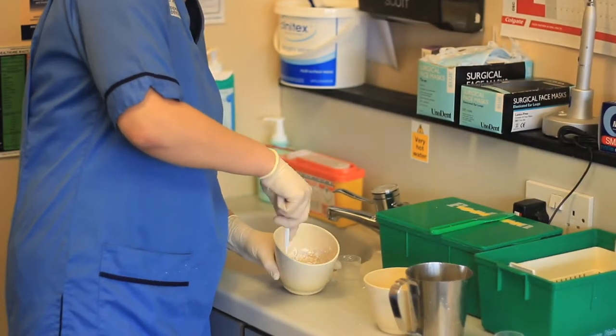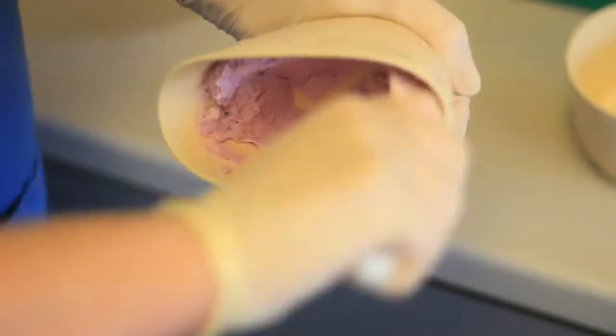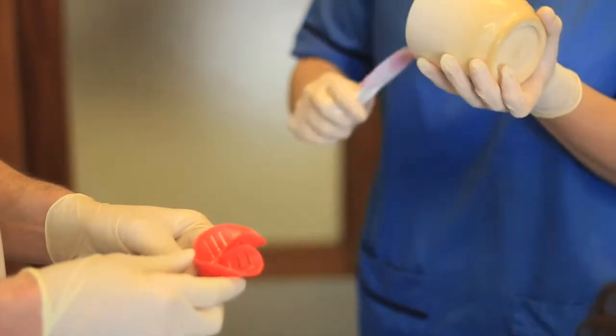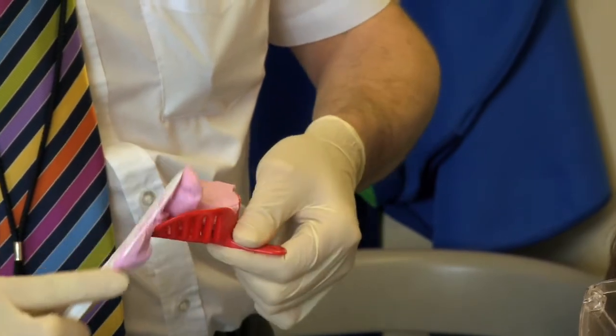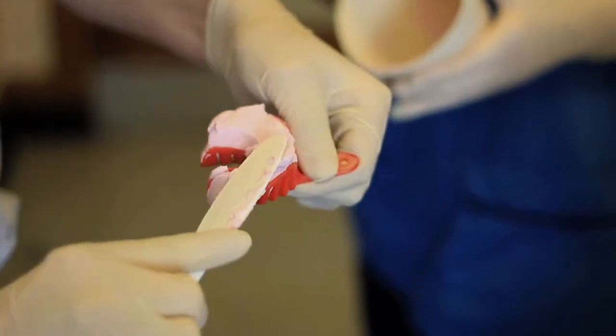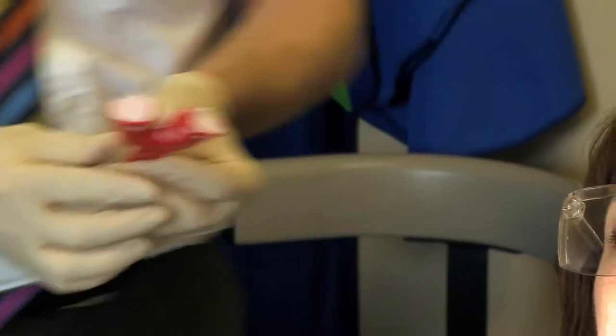Okay, so what we will do next is we will take the impression. We'll start with the lower one and we're going to put some impression material in the impression tray and then squash it over your teeth. Putting the impression material into the impression tray just by gently squashing it in. And then we'll pop the impression in your mouth this time.